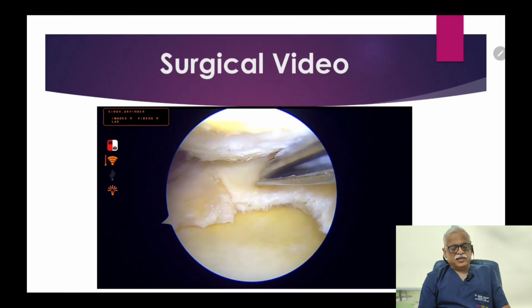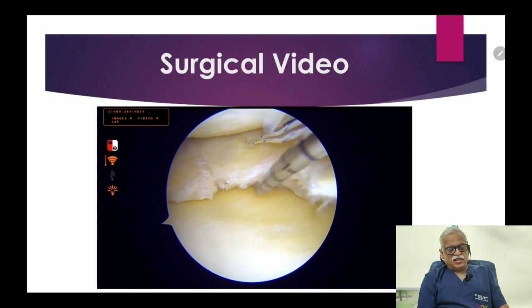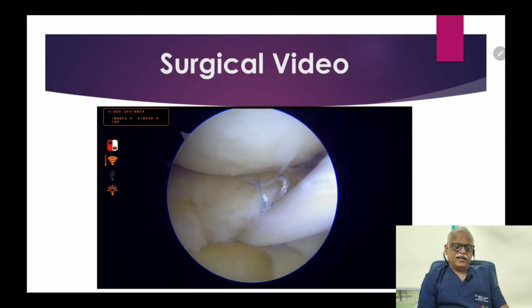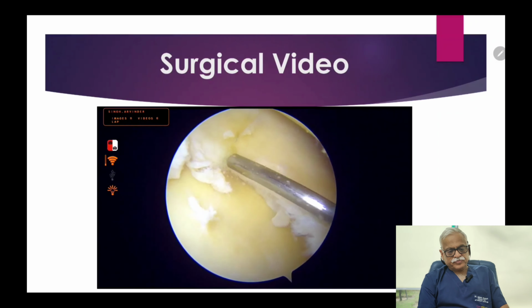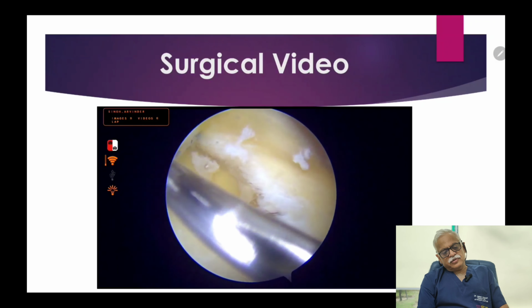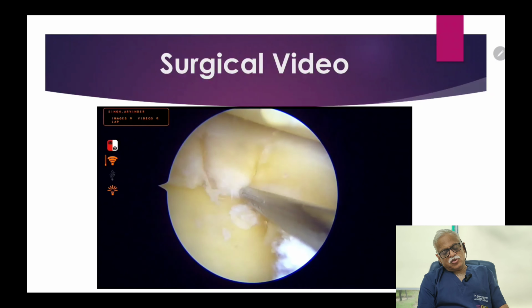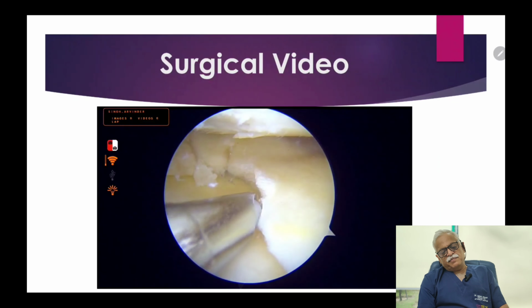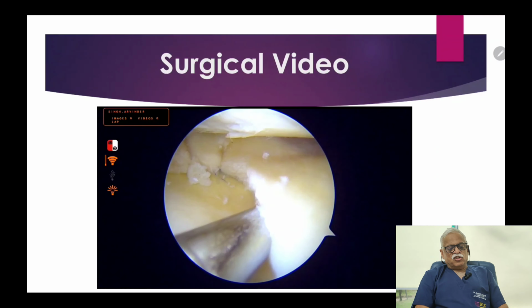So we have the second anchor now going in position. One is above the meniscus, one is below the meniscus, as you can see, and this provides good circumferential compression. Earlier these horizontal tears used to be resected, with partial meniscectomy, which resulted in increased contact stresses and osteoarthritis.